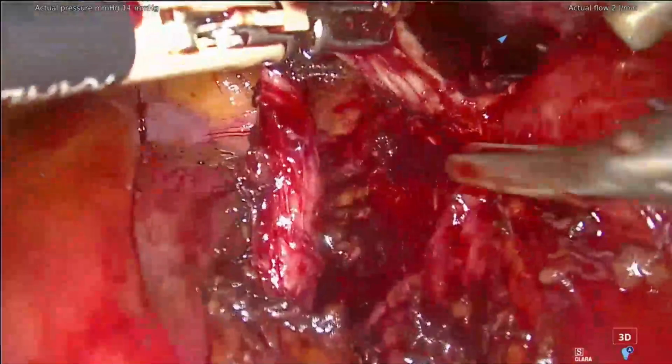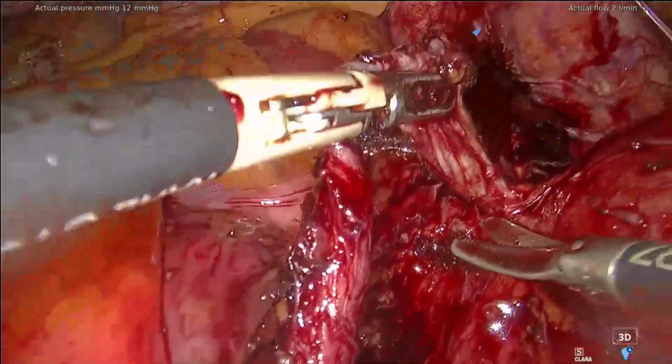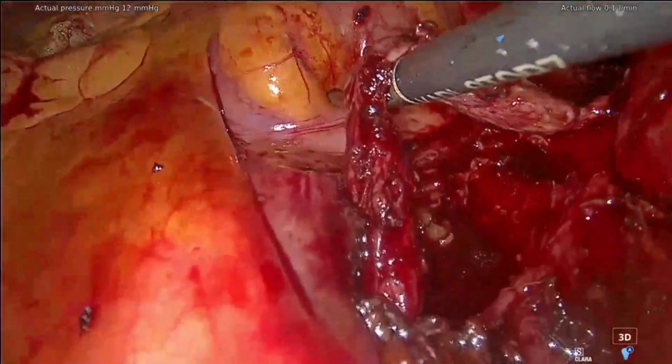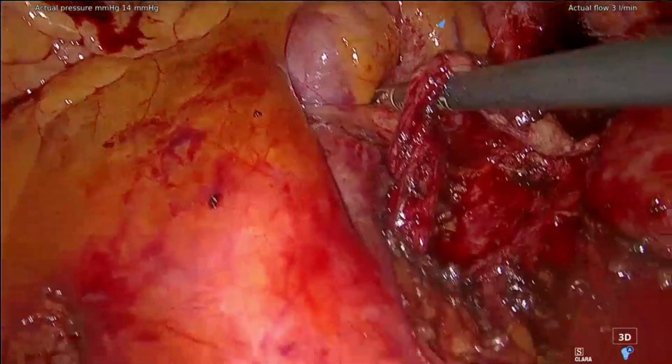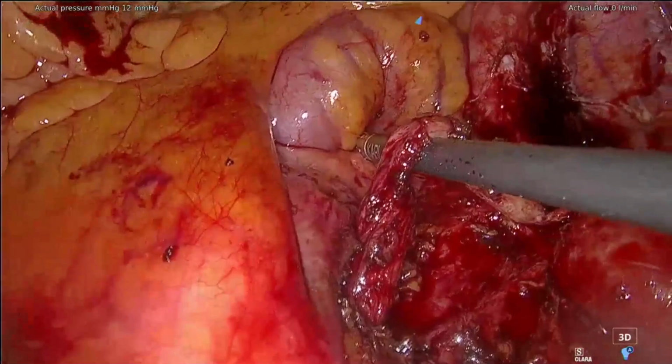Do you have a Hem-o-lok clip for me? Yeah, I think Hem-o-lok. I think I can take the risk to just cut here, but if I have a hole inside the bladder, I will be stupid. Then I just put a Hem-o-lok just here and I cut, and then I remove all the ureter distally, so I can be sure that I will not have a very bad surprise in the future with the remnant ureter. I think you were completely right when you discussed that point. Yes, it's okay. It's perfect.